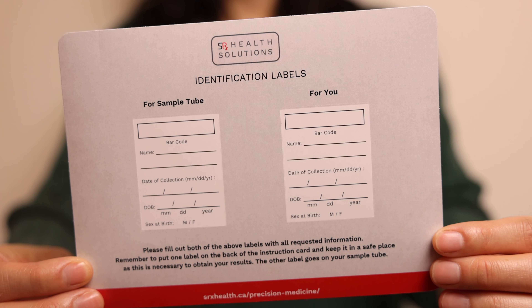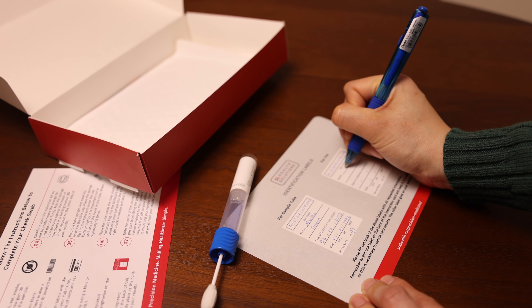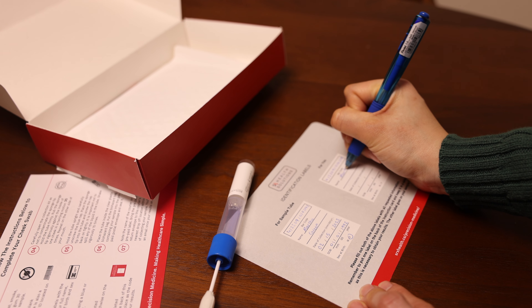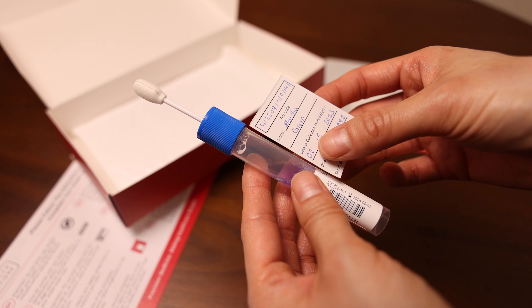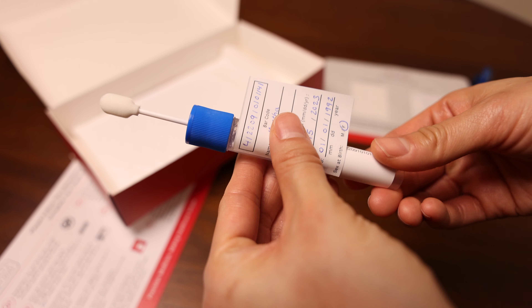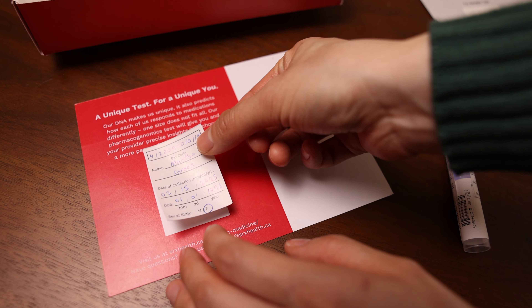Your kit comes with two blank identification labels. Complete both labels with all requested information. Print clearly and legibly using a blue or black ballpoint pen. Place completed identification labels on the sample tube. Put the second label on the back of your instruction card.